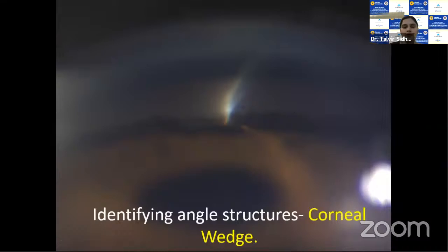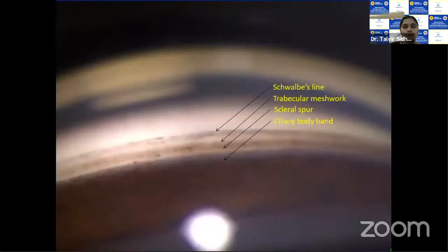This will help you identify that structure. The second important marker for your angle structures is your scleral spur. So once you see the angle structures in a wide beam, you will see that there is a pigmented band-like structure, which is the trabecular meshwork, beyond which there is a stark white colored structure, which is the scleral spur. And beyond the scleral spur is a grayish ciliary body band, and over the ciliary body actually your iris is inserted. Sometimes the iris insertion might be high up, and we'll be talking about that later.